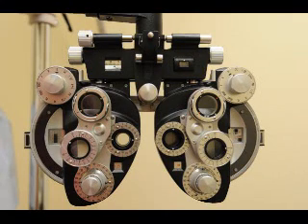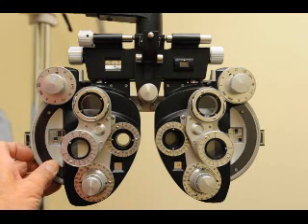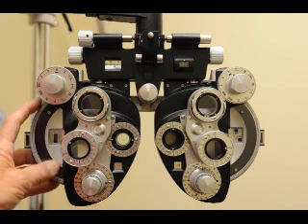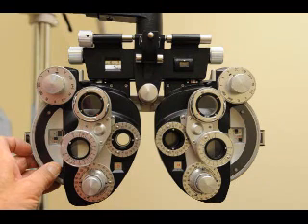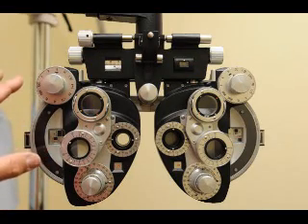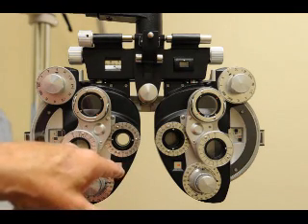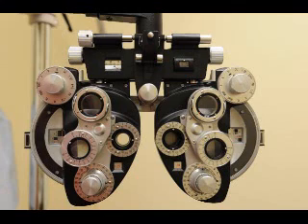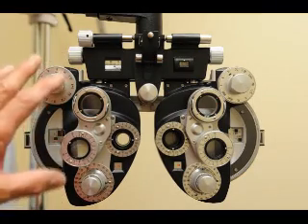Are you guaranteed this is the correct prescription? No. You must check if they'll accept more plus. Add a half diopter of plus — 'Does that blur it just a little bit?' Usually yes. Take it out — now you know that is the correct prescription. If they say no, still clear, give it to them and try another half. You always want to give as much plus as possible — crowd the plus. For cylinder, you always want to give as little power as possible, because stronger cylinder makes glasses harder to adapt to. Use less minus in cylinder and more plus in sphere. The right eye is done.